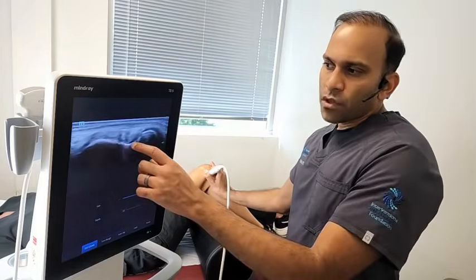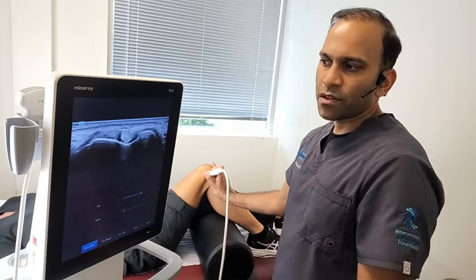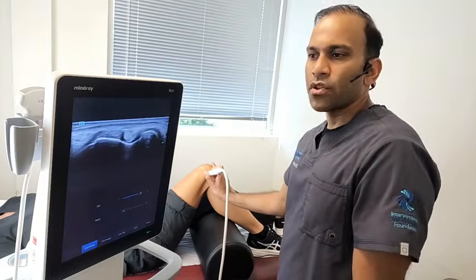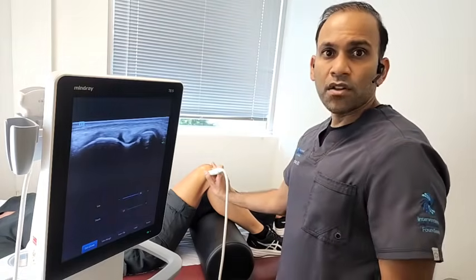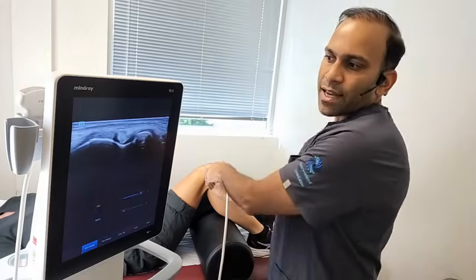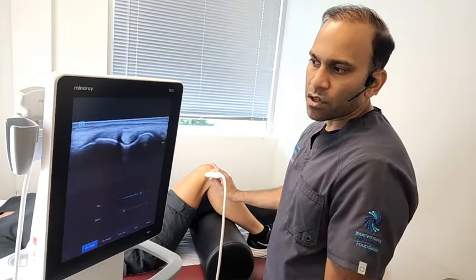Now, we look over here, and this is this kind of round structure, almost kind of looks like an eye. Right? You can kind of see the eye, the pupil over here or whatnot. This eye is actually a tendon that's coming in cross-section, little known tendon called the popliteus. And this tendon actually wraps around the back of the knee and is a part of the mechanism of locking, unlocking the knee. And this tendon actually can cause pain if we have an injury, and it can get tendinopathy or even little tears in it.